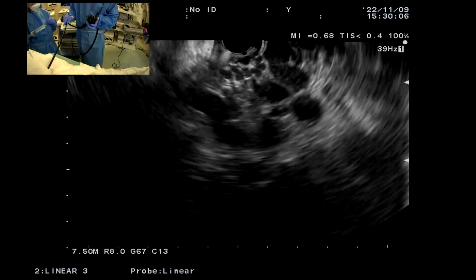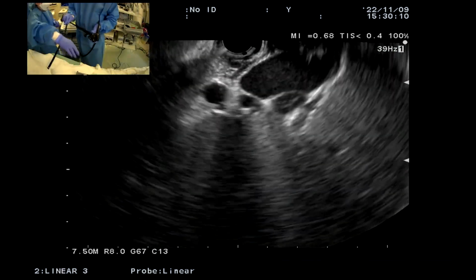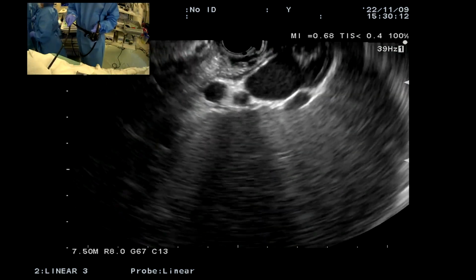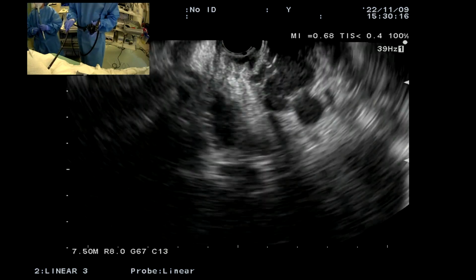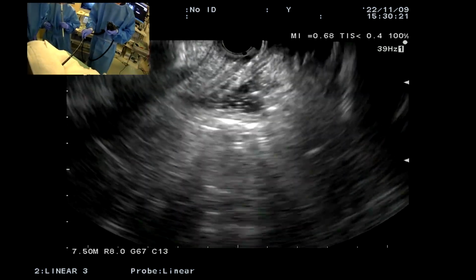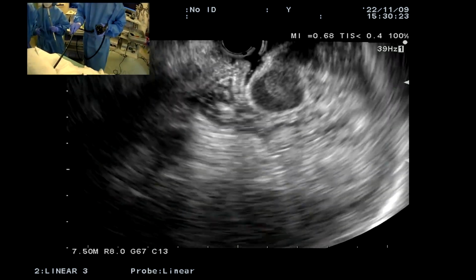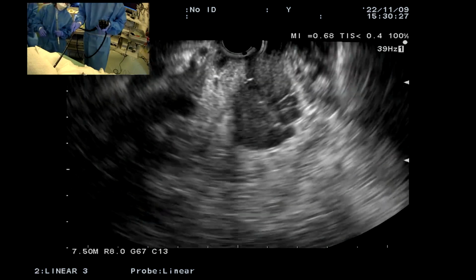Now what we're looking for is to see where the feeder vessel is. So this is outside the wall, right? We're looking outside the wall. You see the MP above. And we're going to look and see where it appears to go inside the wall. So just looking for that transition. And we would ideally like to do a transesophageal access.